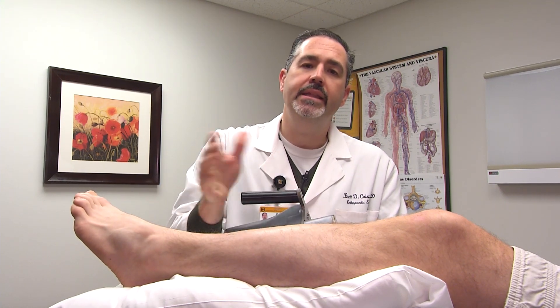This device helps either lengthen or shorten the rod one millimeter per day, and we basically judge the amount that they need based on x-rays as well as how their leg looks clinically. Once their bone is healed, then we go back and take the rod out, and then they do their rehabilitation and get back to the activities that they would like to do.